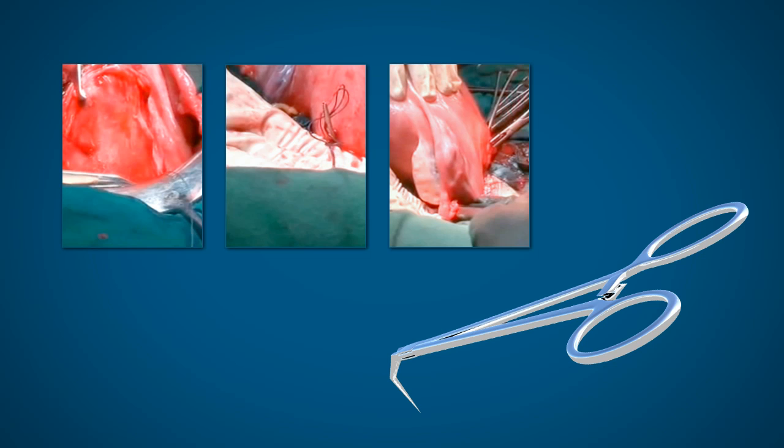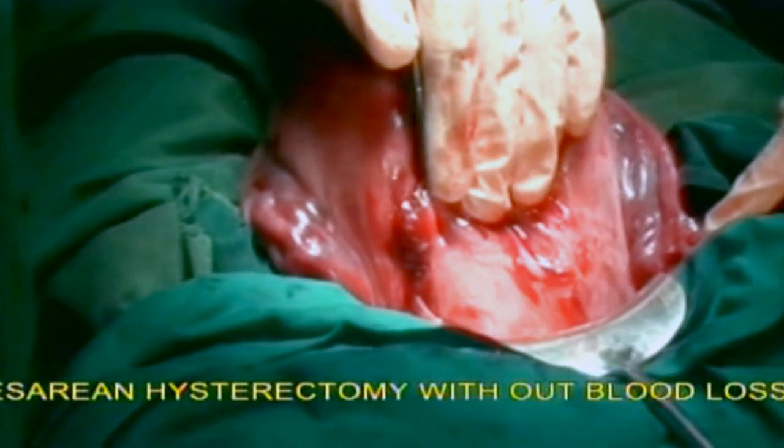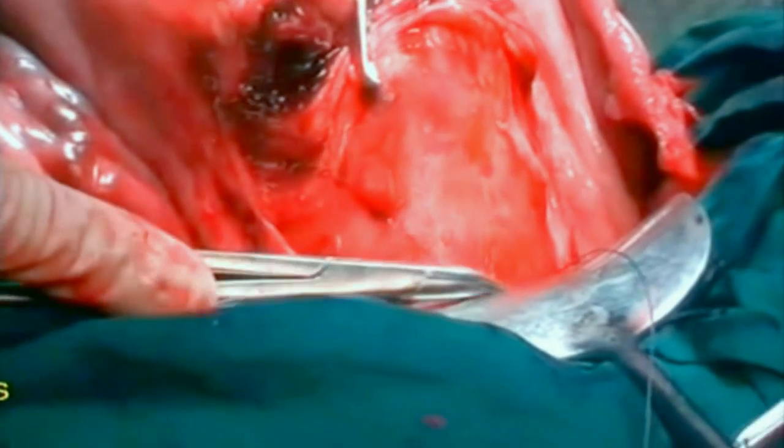Now I will demonstrate hemostatic suturing in a case of cesarean section. The UV fold is opened and the bladder is pushed down. The PUL forceps with the thread at the tip is pierced from anterior to posterior side like this.